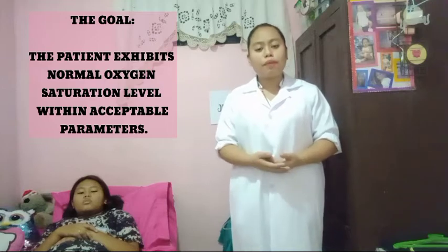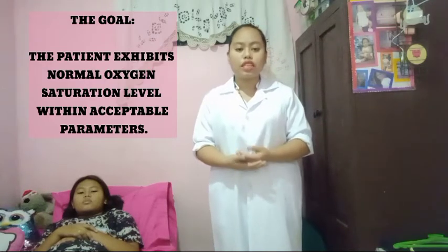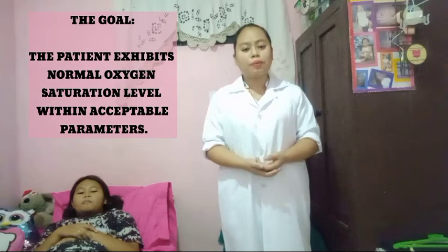In this video, I am going to demonstrate a procedure which is administering oxygen via nasal cannula. The goal of this procedure is that the patient should exhibit an oxygen saturation within acceptable parameters. The purpose of this procedure is to deliver low concentration of oxygen when only minimal oxygen support is required, to allow uninterrupted delivery of oxygen while the client ingests foods or fluids.